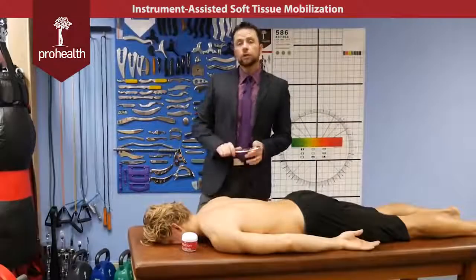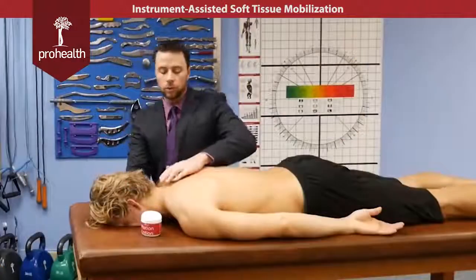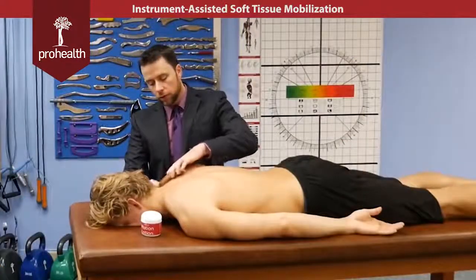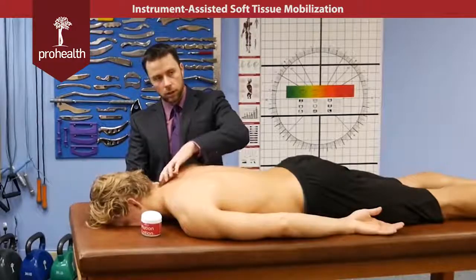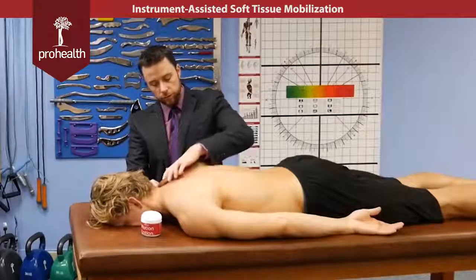So we're going to look at the ProStim 1 tool basic application. Generally what you want to do, you'll start with a scanning stroke to begin with, where you'll just work through and look for any areas of tightness or stiffness, or a little bit of fibrous adhesion maybe, or just roughness in the muscle itself. Okay?